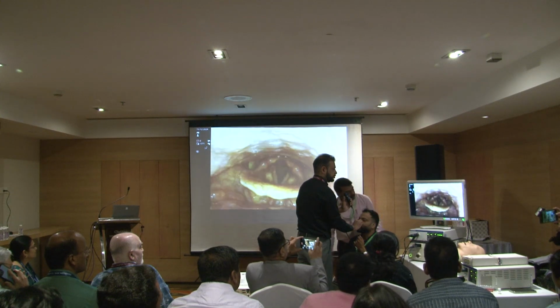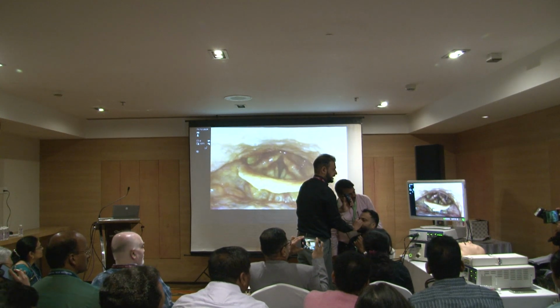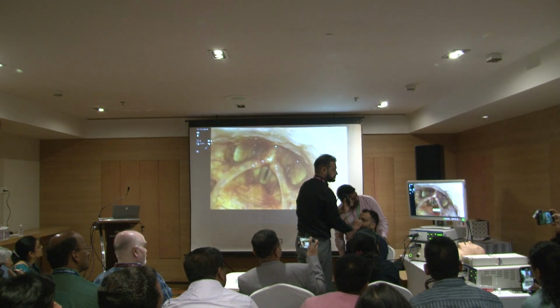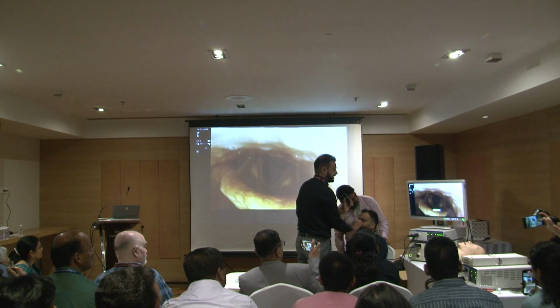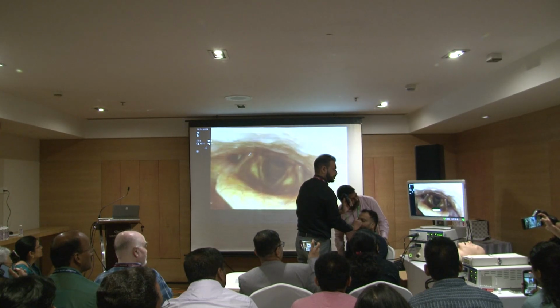Right, now we are into stroboscopy mode. As I go down, first at the level of the epiglottis, I will see the entire vocal cord. I am not going further down, which I should ideally, because we will have some cough reflex. Now say E.